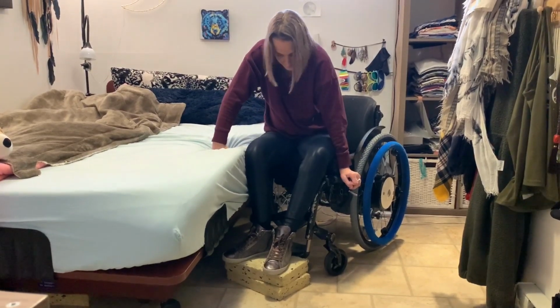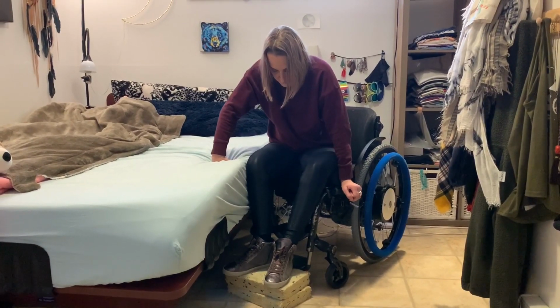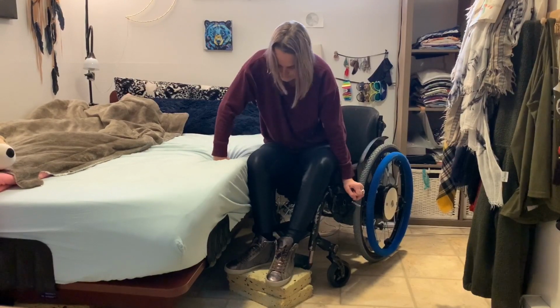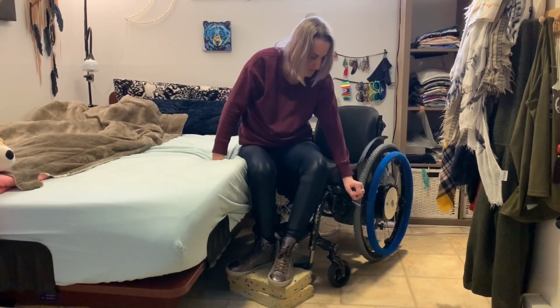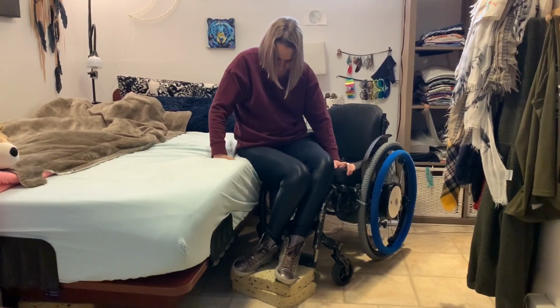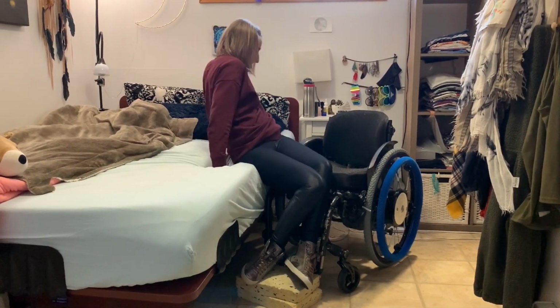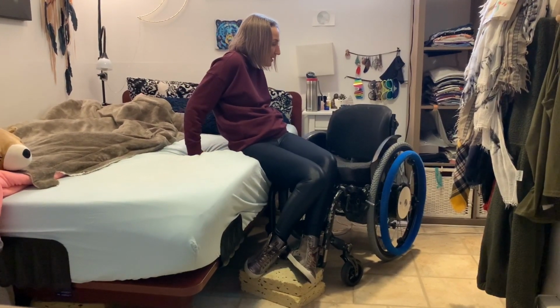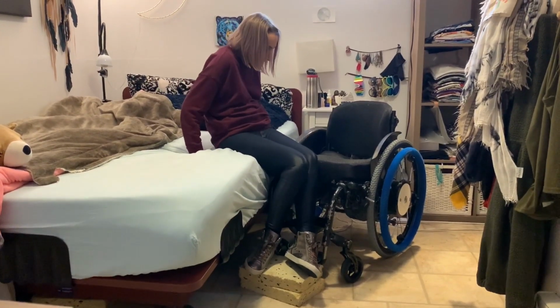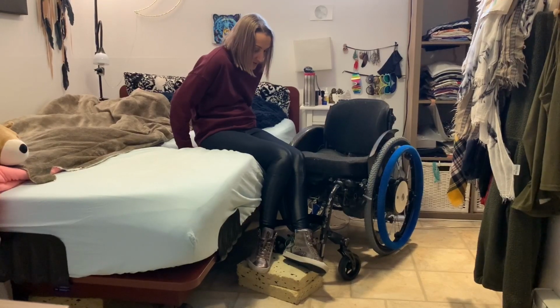And then pushing with my left hand and pulling with my right hand, trying to get onto the bed. And also shifting my weight forward, to get my weight off my bum basically. And also trying to lift up a little bit to be able to make it onto the bed. And then I'll bring my hands behind me and start pulling. I do have a little bit of triceps, so it does make that easier.